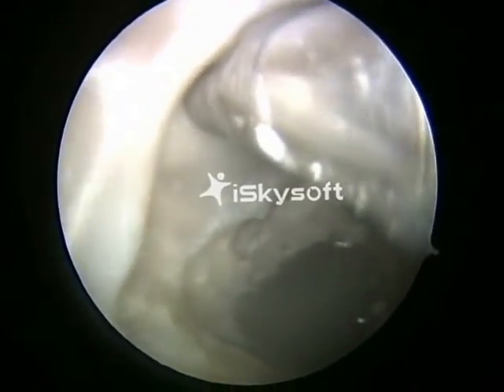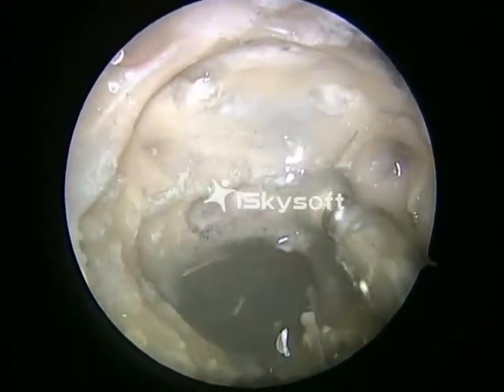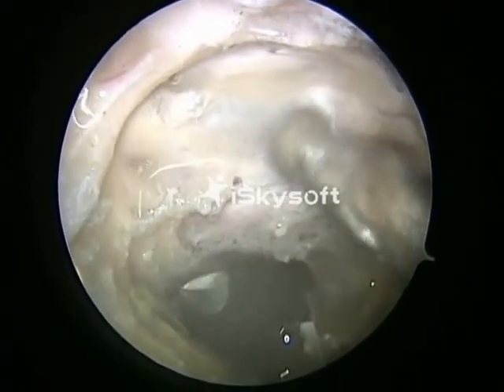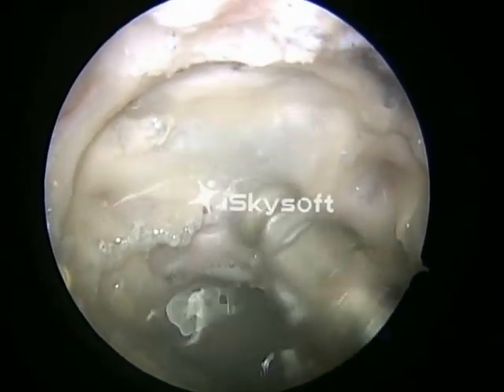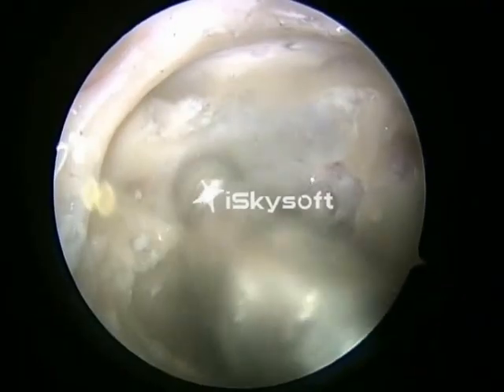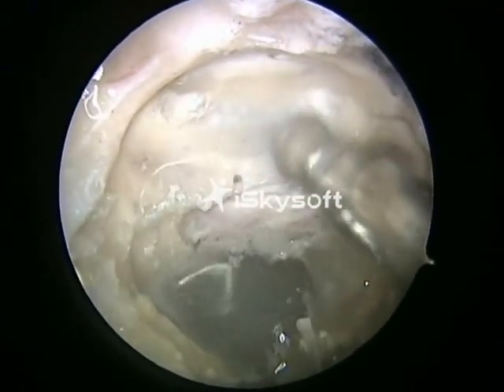And then would be a transtubercular approach. For the transtubercular approach, we drill the bone like a curve. In fact, the curve on both sides delineates the internal carotid artery.